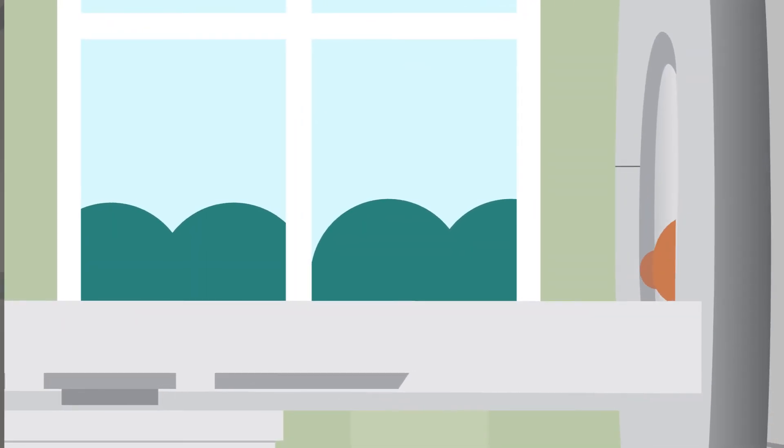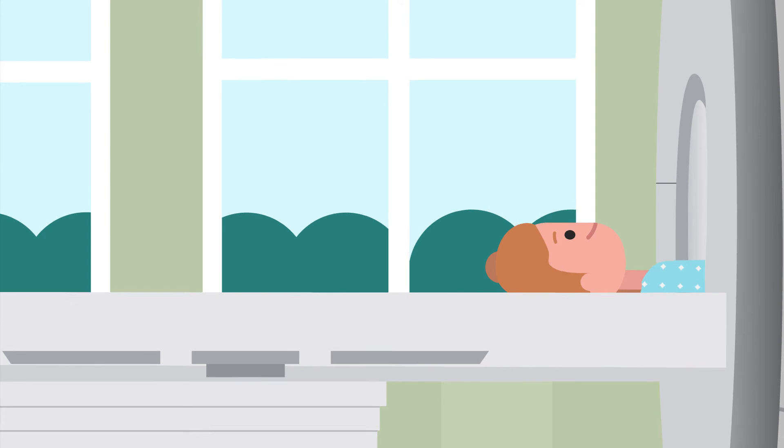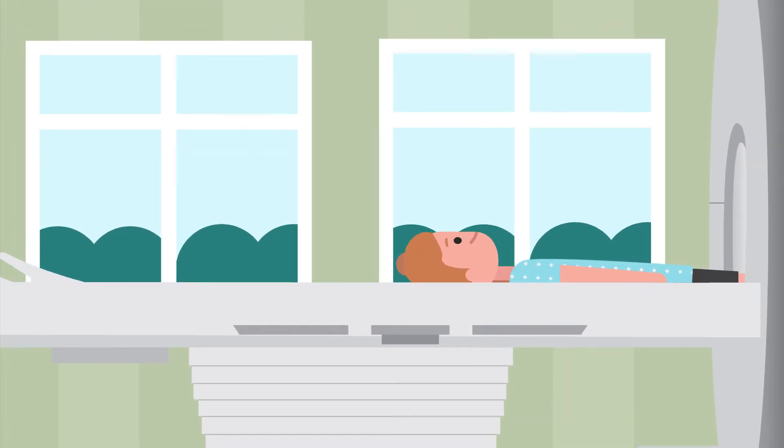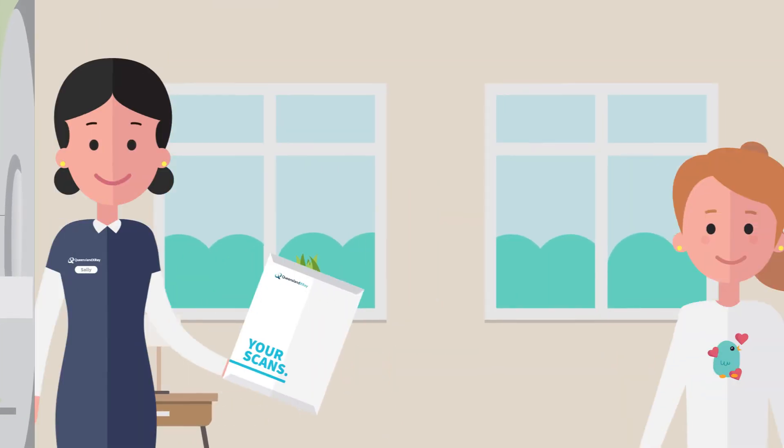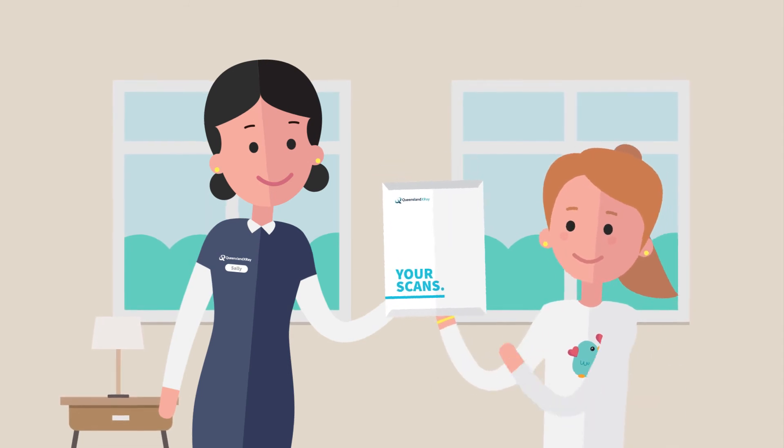When the pictures are all taken, the bed will move back and you are free to get changed and head back out to the waiting area. Your results will usually be ready the same day.